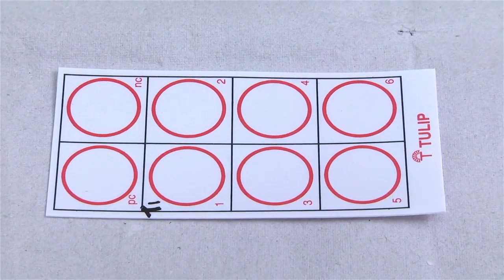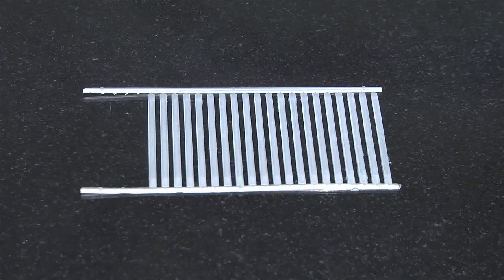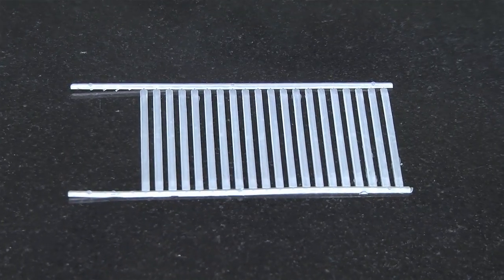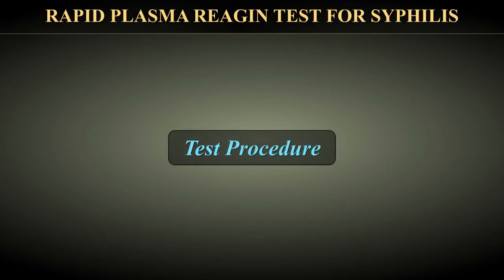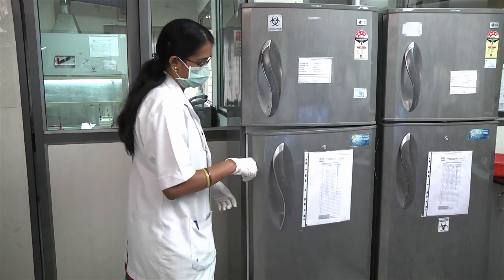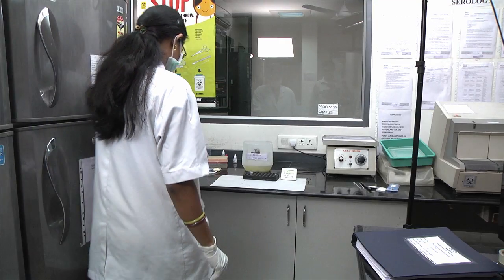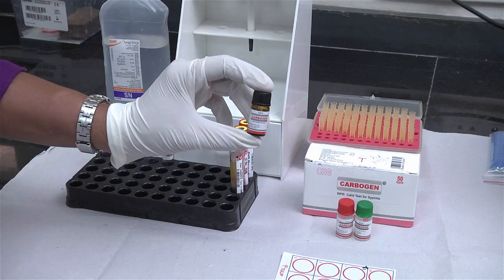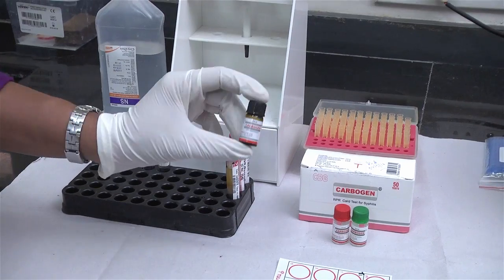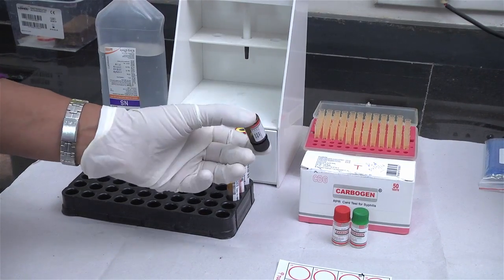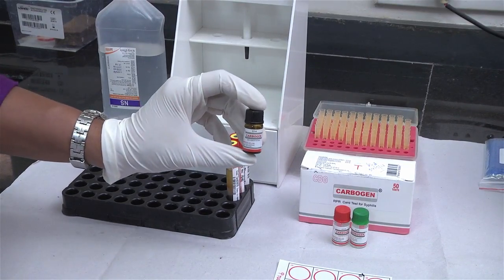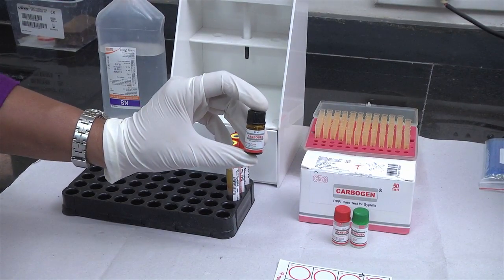RPR cards and mixing sticks are also required. Bring reagent and samples to room temperature before testing. Thoroughly mix the carbon antigen reagent suspension by gentle agitation before testing.